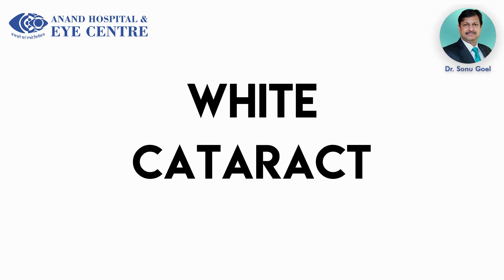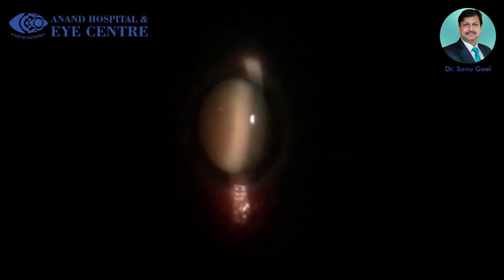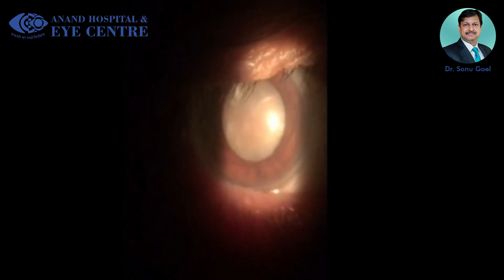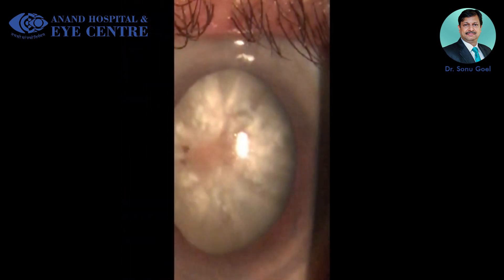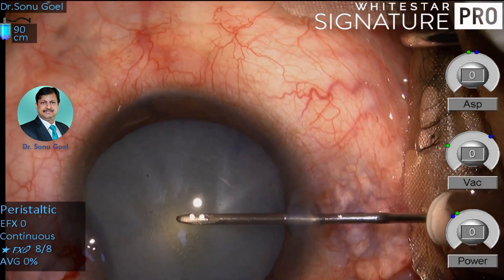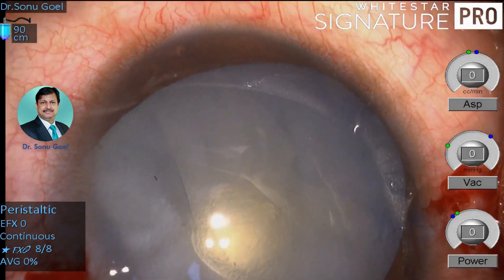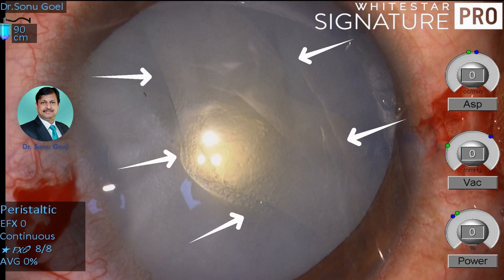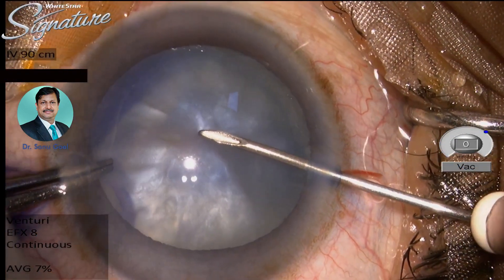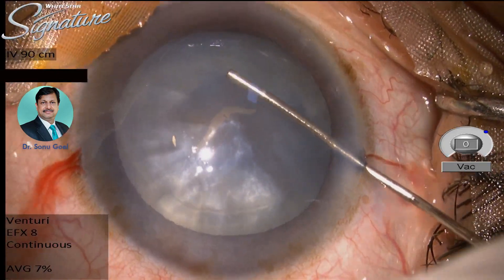White cataracts are quite challenging. In our routine OPD, we find these patients presenting in two major ways: white with high intralenticular pressures, with thick fibrosed anterior lens capsules and a hard nucleus inside. The biggest challenge in these patients is creation of capsulorexis — a small touch and you find an Argentinian flag sign because of high intralenticular pressures. To manage this is quite tricky, and here we present the ways in which we can manage it in our routine surgical arena.